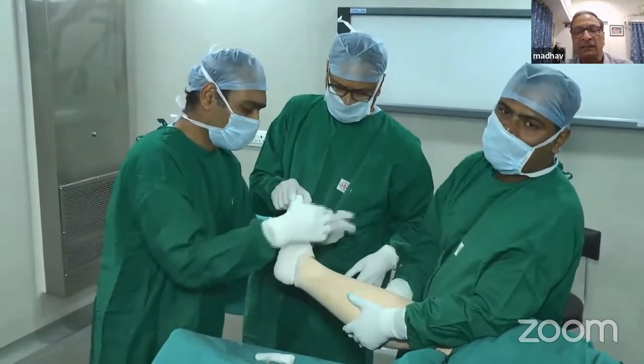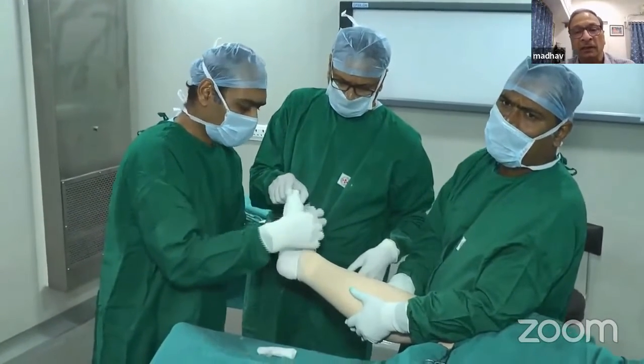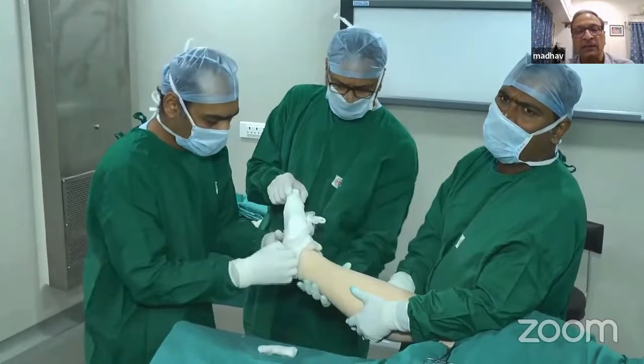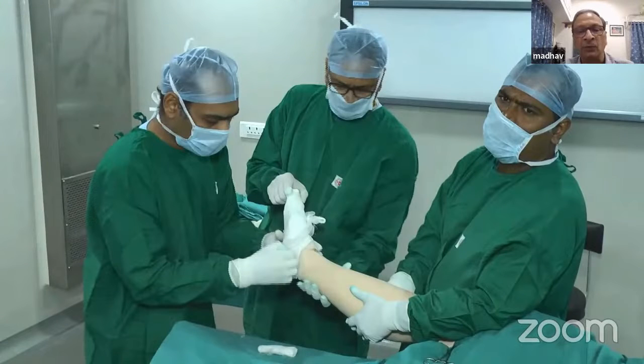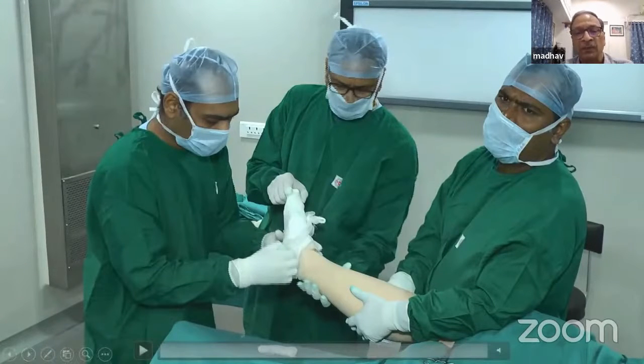Now you can see that the lower extremity from ankle up to the knee joint is exposed. If that is the area you are operating on, you have a completely isolated field. The rest of the field is completely covered by sterile drapes, which will avoid contamination. This setup is for leg and ankle surgery.